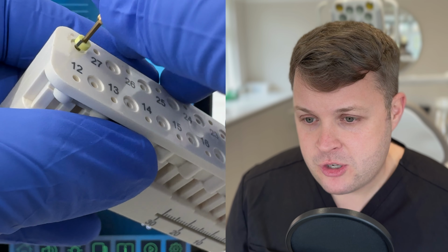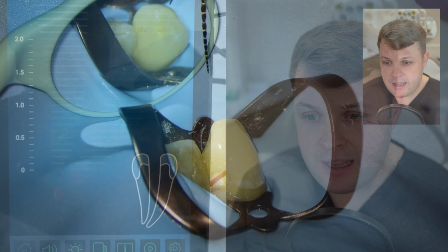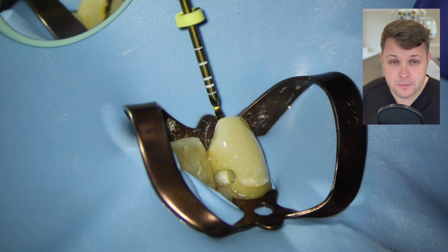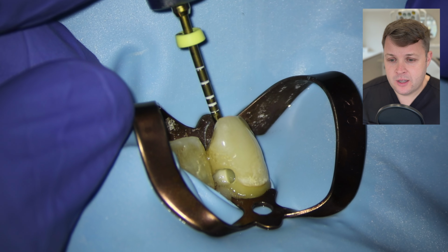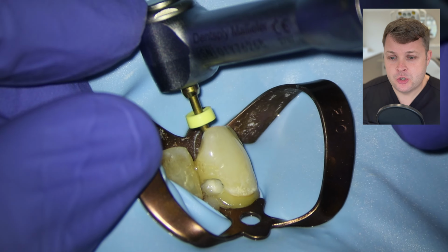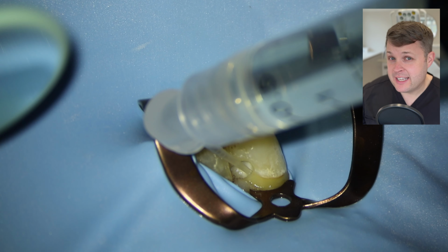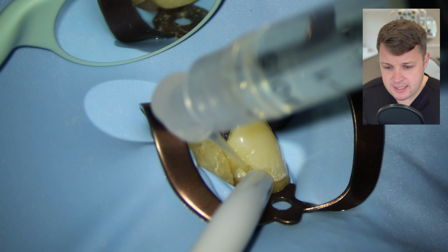We're then going to have to open up some extra long Wave 1 Gold hand files. HiFlex don't do extra long files yet. Apparently they're going to be coming at the end of the month. And I'm just going to use a size 20 Wave 1 Gold file here just to give it a good old shape out. I'm doing a lot of sweeps there, but actually I feel like it's going to length quite nicely.